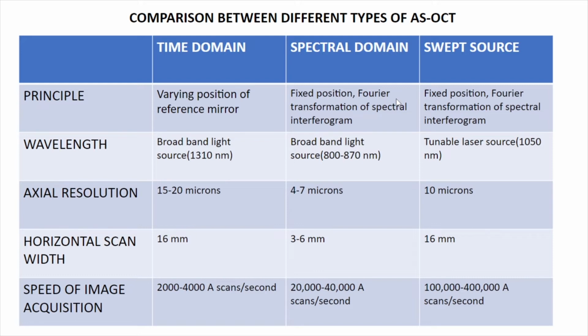But generally we use UBM. Can one of the second years say why we use UBM most of the time for imaging? Sir, because in ASOCT, the rays are not penetrating posterior to the iris. Why? It's theory. Sorry, I can't hear you. Use the mic. Refractive index, is that correct? And the depth of penetration because of the frequency interferometry. Yeah, with the swept source OCT, no, the depth of penetration is better. Actually, you have not mentioned the depth, is it? It comes in the next table.